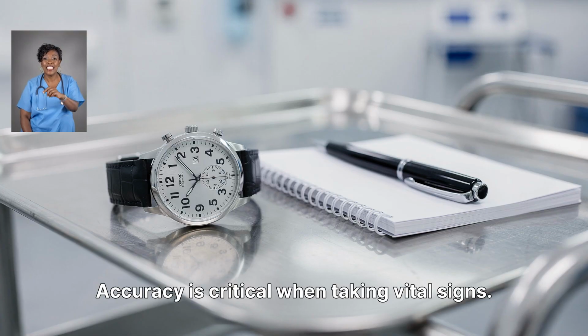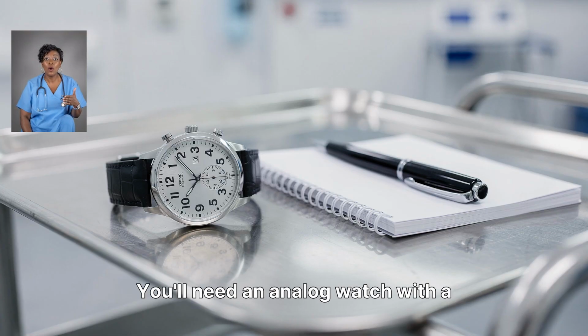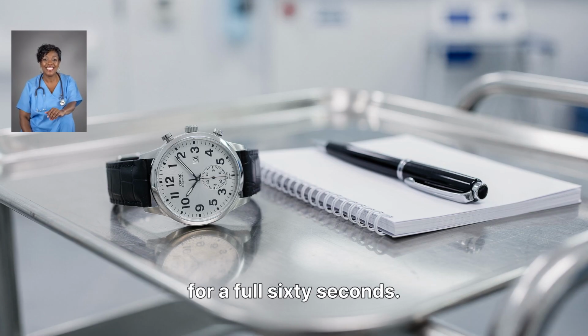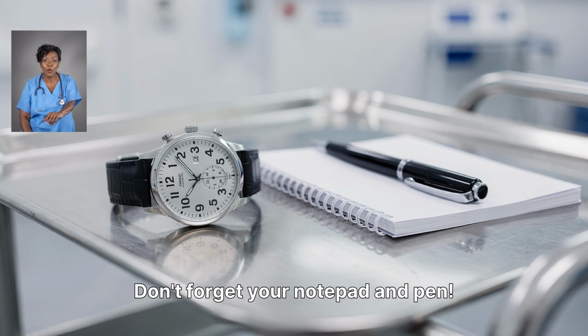Accuracy is critical when taking vital signs. You'll need an analog watch with a second hand to count pulse and respirations for a full 60 seconds. Don't forget your notepad and pen.